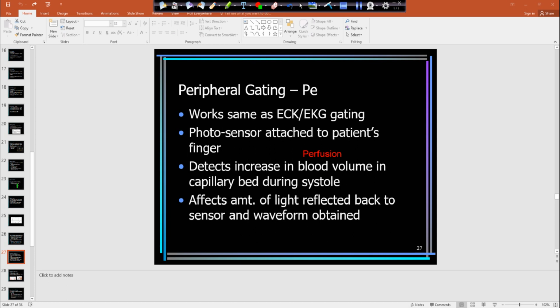So you say blood volume is perfusion? Yeah, blood volume to tissue. So how is that blood volume getting to the tissue? Because if you have a decrease in blood volume going to a particular tissue, that could be indicative of a certain pathology, like in the brain. Like if you're not getting blood flow to a certain part of the brain that normally does, they could say, oh, there's a restriction within the vessel, or there's a tumor, or there's other things. So you get that perfusion imaging, and then you get that beautiful color mapping that goes along with it.